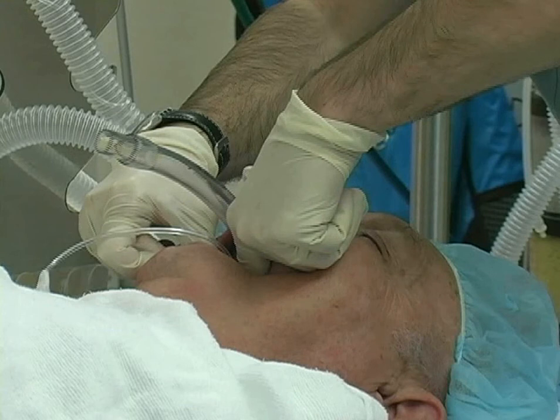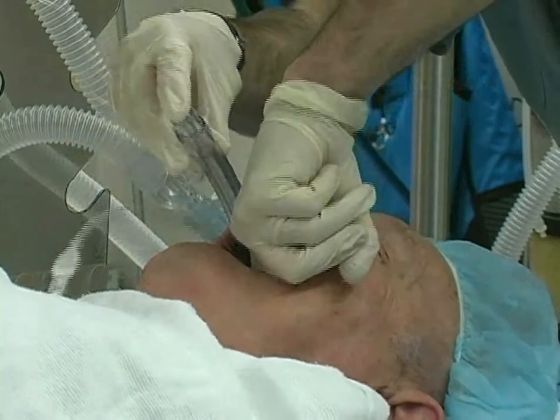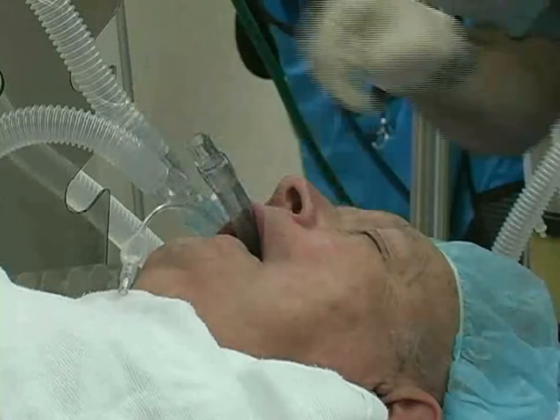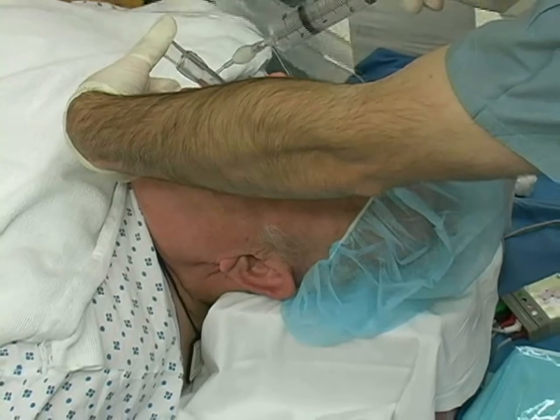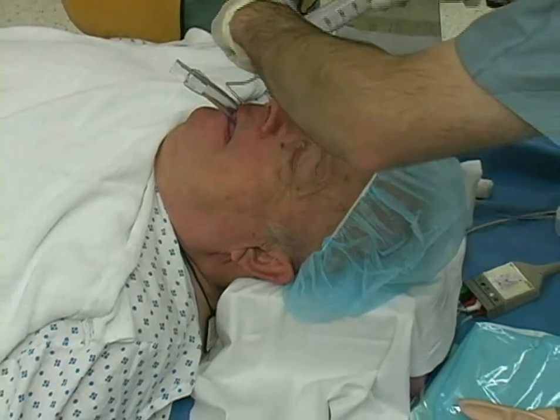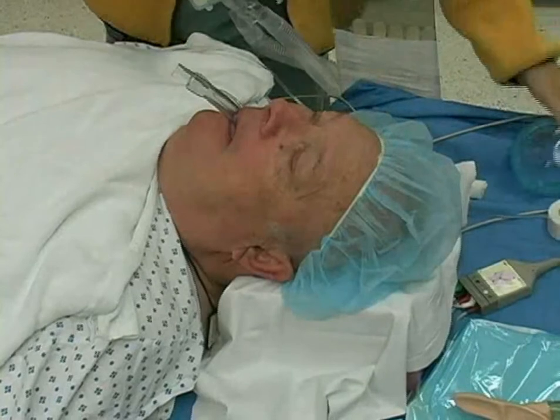With the entire bulb and cuff inside the mouth, release the tube from your thumb. Continue to direct the LMA with your index finger. Advance the tube until the LMA rests in the hypopharynx. From a fiber optic viewpoint, you can visualize the correct location of the laryngeal mask airway in the hypopharynx above the glottic opening. Using a clean syringe, inflate the cuff with the recommended volume of air. Do not inflate to a pressure of more than 60 centimeters of water. The LMA may rise slightly out of the hypopharynx when inflated.